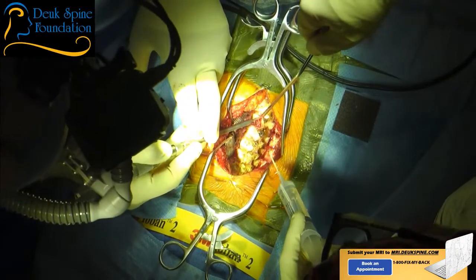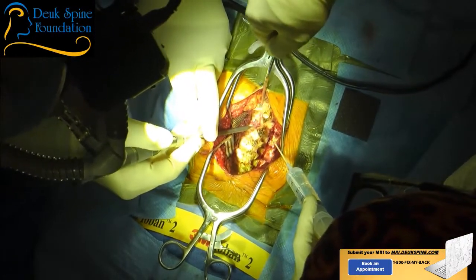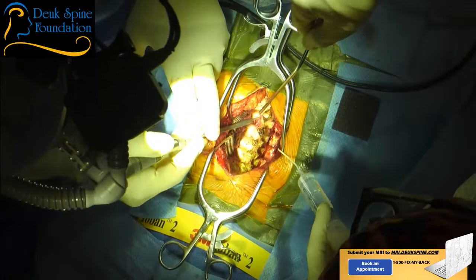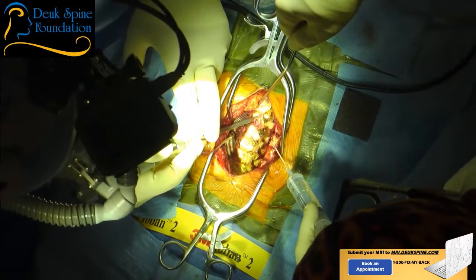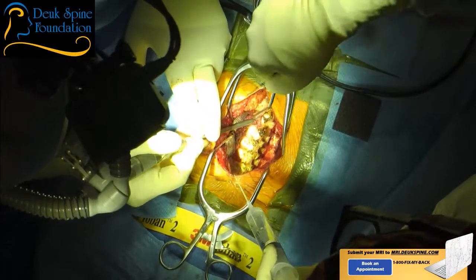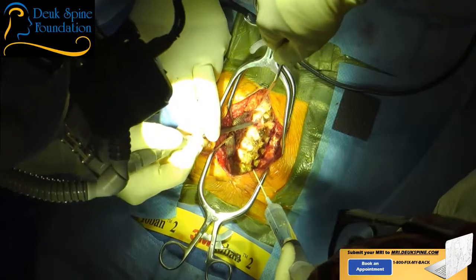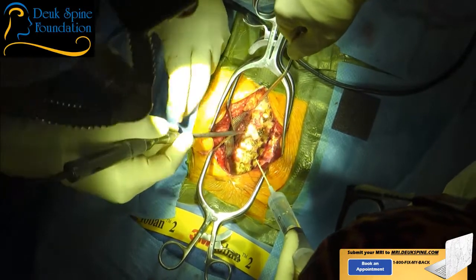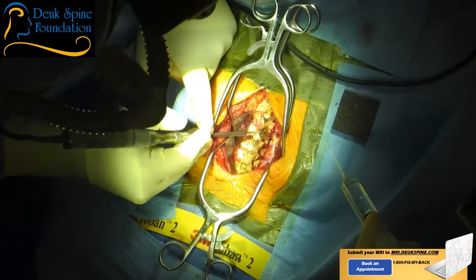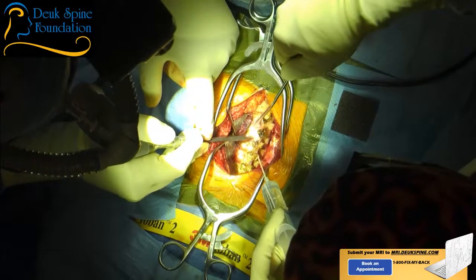And that's one thing that you need to learn as a good spine surgeon, what's called hemostasis. Everyone just thinks hemostasis just means stop bleeding. It does. But what you need to understand is that different tissues bleed differently, and you need to know the strategy that's best to stop bleeding depending on what's bleeding. And you have several tools available. You've been watching from the beginning, you've seen the tools: Bovie, bipolars, bone wax, gel foam and thrombin. Heck, in the old days, they used to tie blood vessels off with suture. Thank God we don't do that anymore because it doesn't work very well.